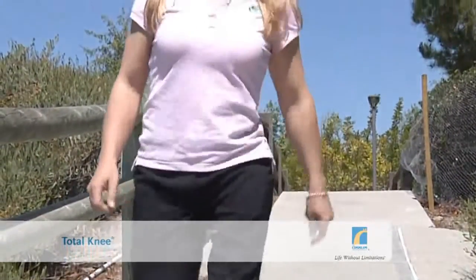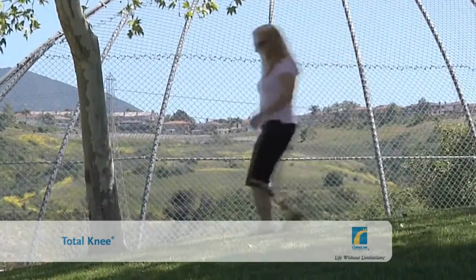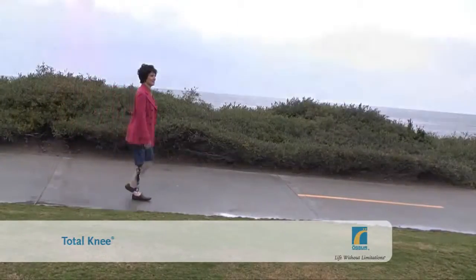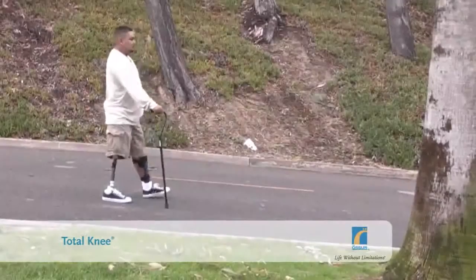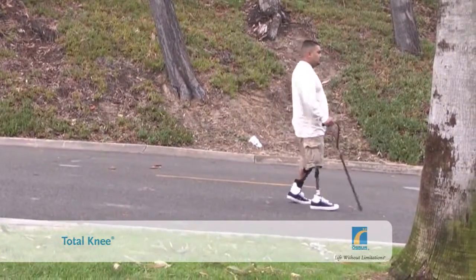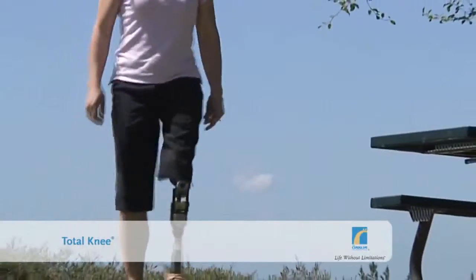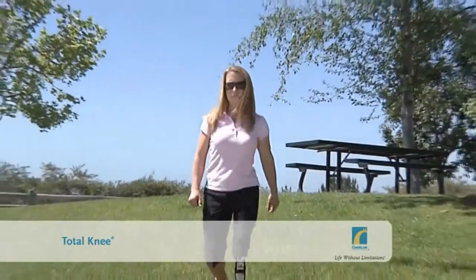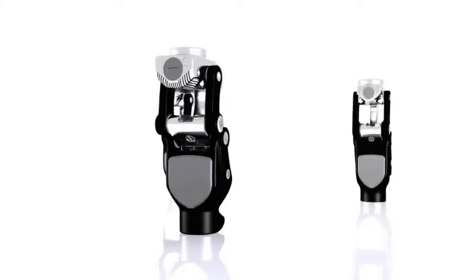The sound foot should be in front of you and ready to receive weight. If you are a new amputee or the slope is quite steep, you should approach with caution and make use of available railings for added security. Start by practicing a step or two near the bottom of a slope, where it meets level ground. On steep slopes, you will find it easier to sidestep your way down with the total knee.